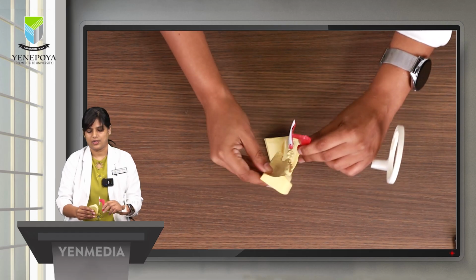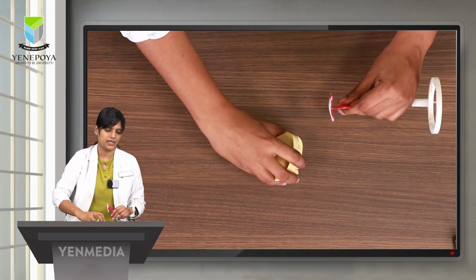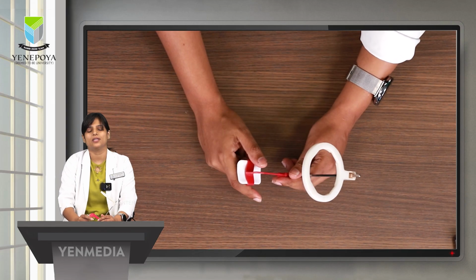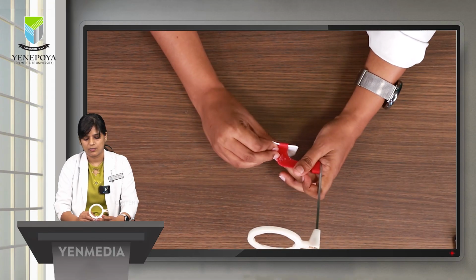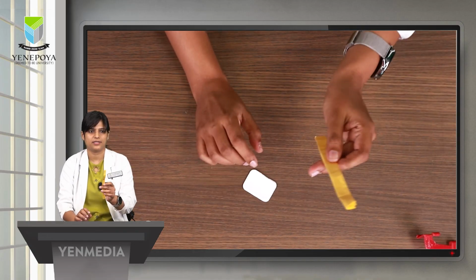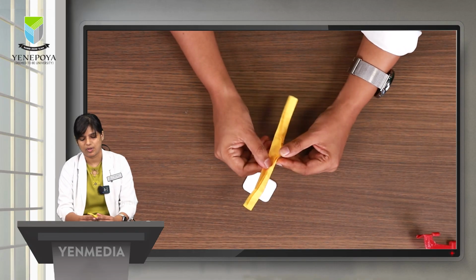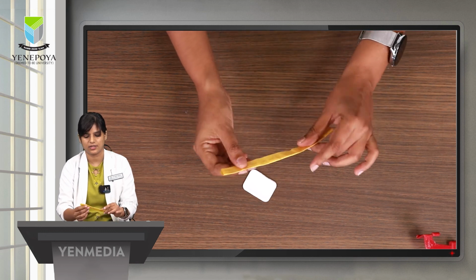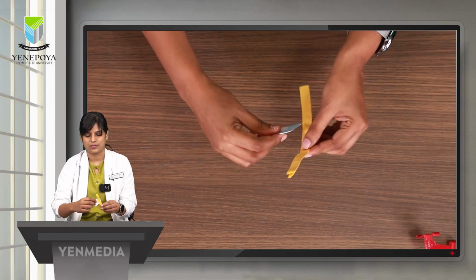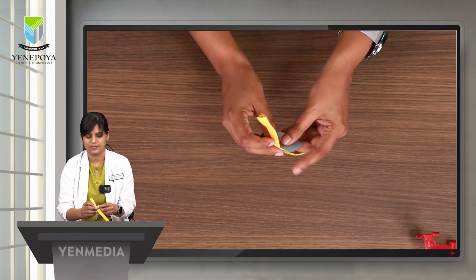Okay. Now there is another small hack. In case you all don't have the RIN XCP or the Bitewing tab, one way you can do is you can manually make one as well. Let's say just take a sterilized paper like this, it should be sterilized, fold it, and position the paper like this.